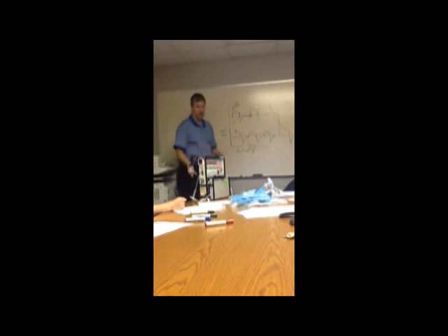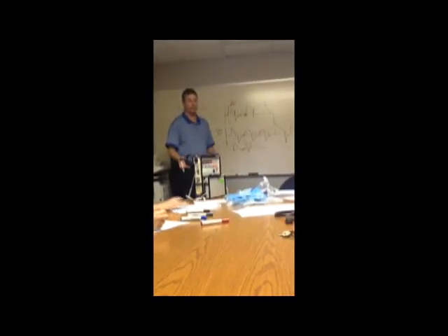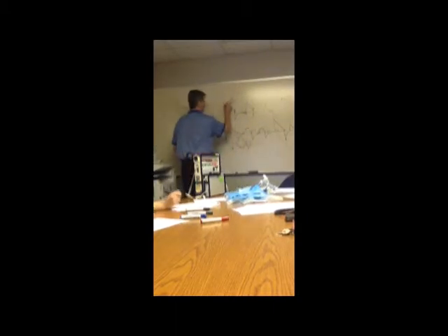All right, so the last mode we'll talk about, or breath pattern, is CPAP. CPAP can also be pressure support. So it's CPAP with pressure support. It's essentially what BiPAP is, and I'll explain it a little bit in a second. But this is the same as the other, and I'll move my head in just a minute. Time, and this is flow, all right?